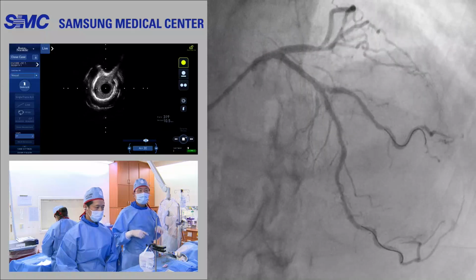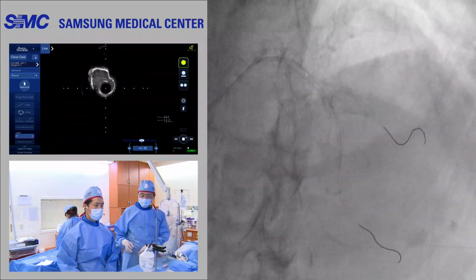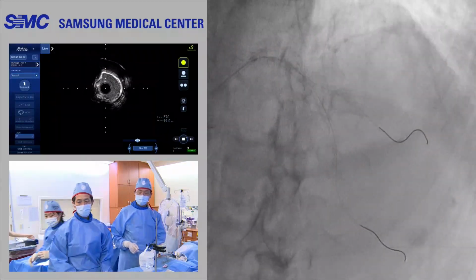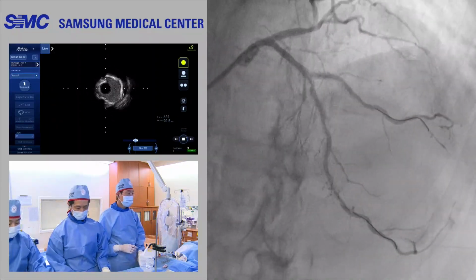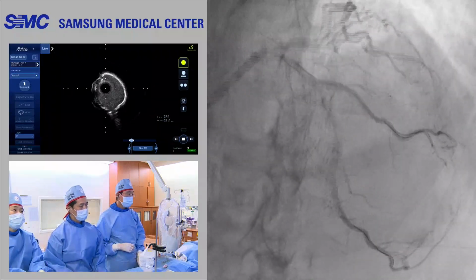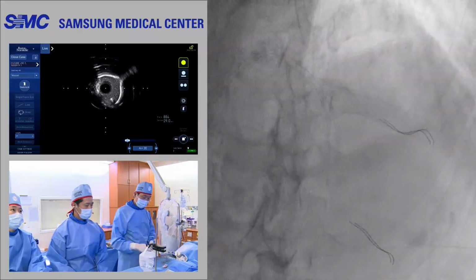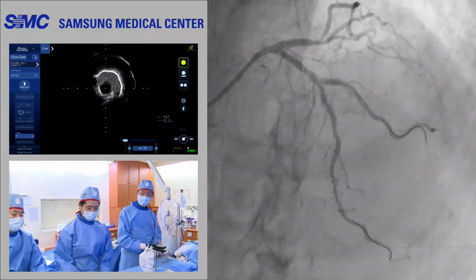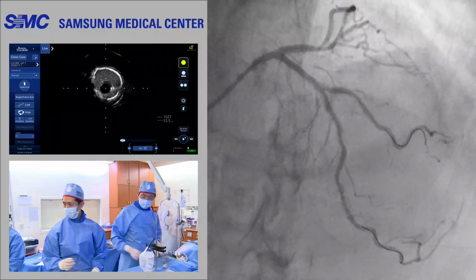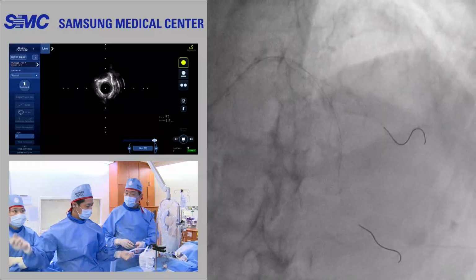Who can mention the effect of DCB on the calcified lesion? DCB 2.75 by 20mm. I'm really curious about the DCB in severe calcified lesion, because if we do the DCB, most of the drug will be delivered on the calcium surface. But actually, subgroup analysis of calcified lesion is not so bad. No significant difference as far as I know.